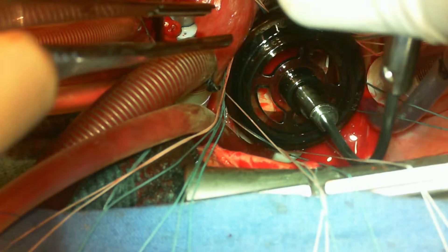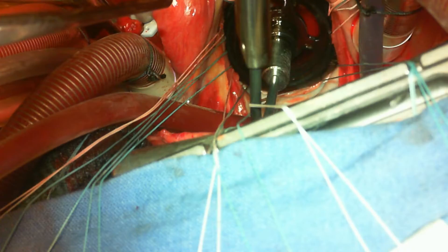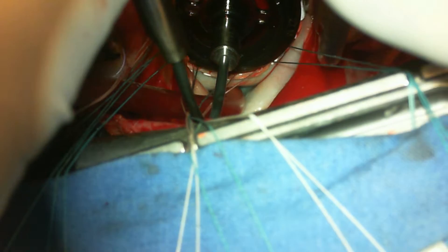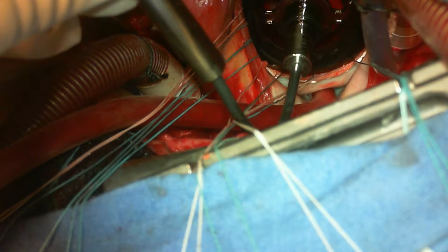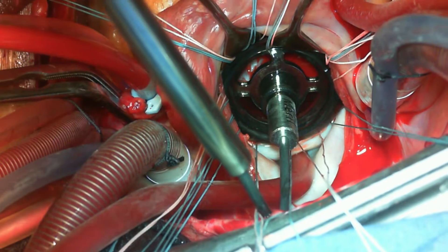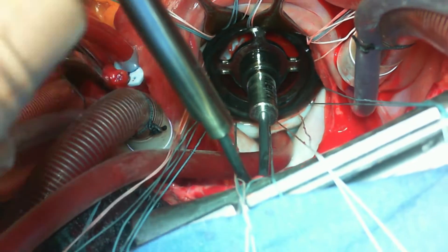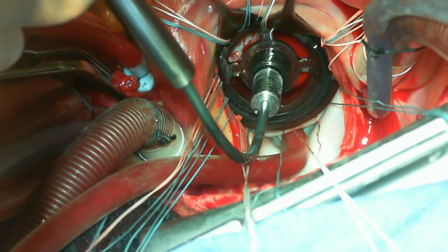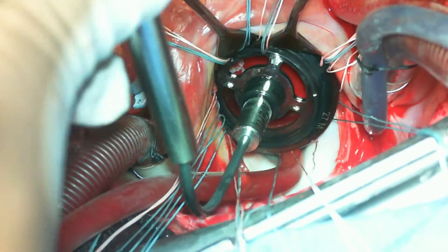Mind you, this is a collapsed state and the sutures which you have placed are on the organizer, which is trying to pull or distort the annulus. Following these basics — seeing the pledgets after having placed the obturator in the annulus and removing the obturator smoothly — will ensure the perfect sizing.